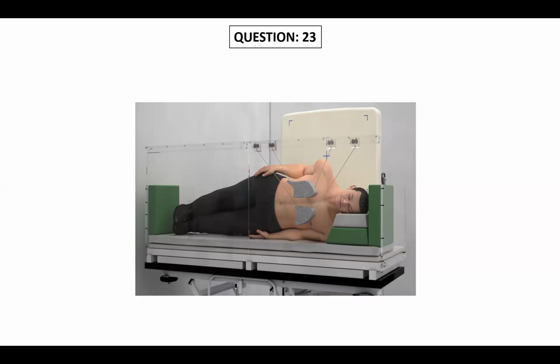Yes, sir. In the supine position, from the right side to the left side the separation is more, so the dose is less homogeneous, but patient comfort is more. Many pediatric patients we treat are non-cooperative, and some are under anesthesia, so they cannot stand in APPA position. So this is the compromise. Supine is more comfortable for the patient but dosimetrically more inhomogeneous. APPA is more uncomfortable but more homogeneous. So this decubitus position is like a compromise between these two.